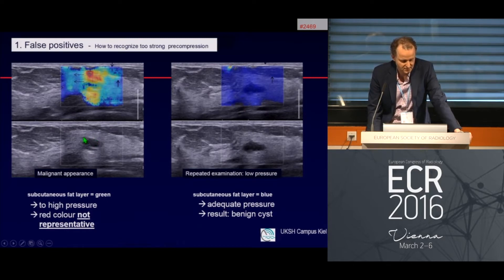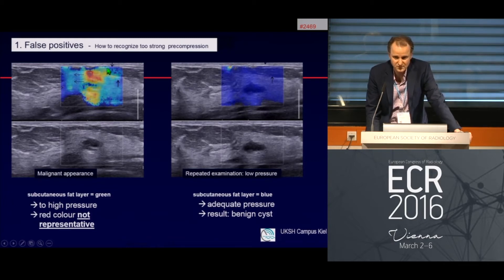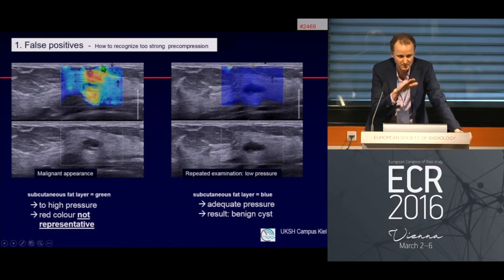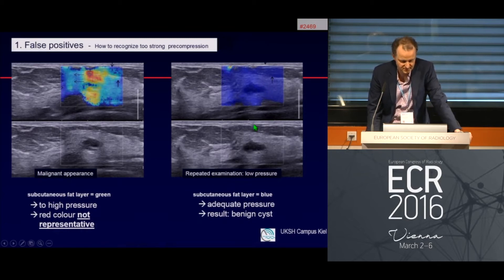How can we recognize false positives from strong compression? The lesion looks benign in B-mode, but we see red color in and around the lesion, and importantly turquoise or orange color close to the skin — a sign of over-compression. When we repeat with very low pressure, the subcutaneous fat layer appears blue, confirming adequate pressure and revealing a typical benign finding.